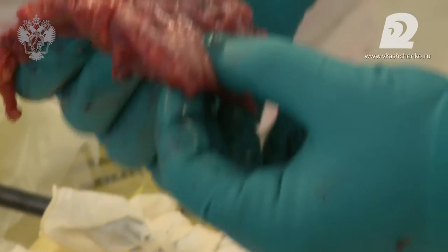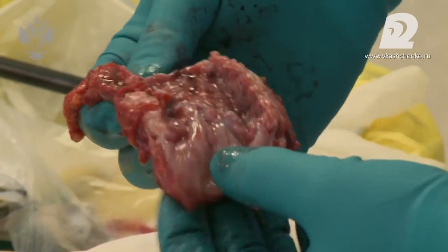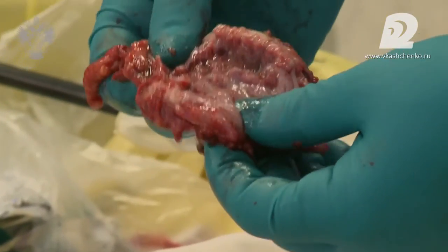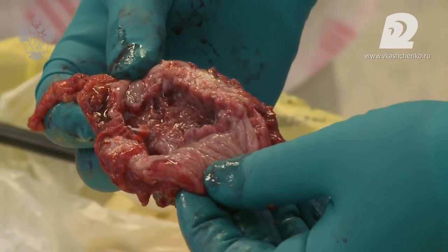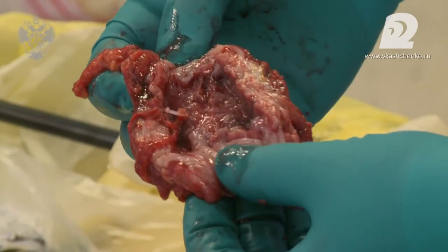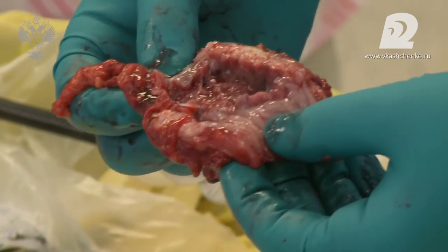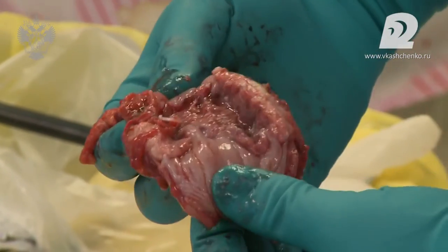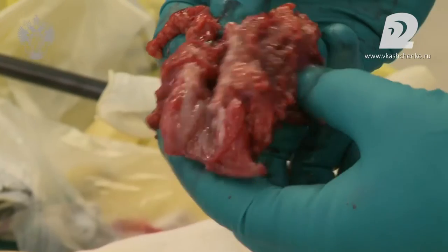That is why I think that I can remove the specimen via the thoracic area incision, because it will allow me to avoid the possible contamination of the abdominal area. These are resection margins, and we shall widen them some 4-5 centimeters to both directions, because we are going to remove the cardia part of the stomach and the lesser or the greater curvature. And also there will be anastomosis, which in fact will also be sutured further on. So it's one of the options.